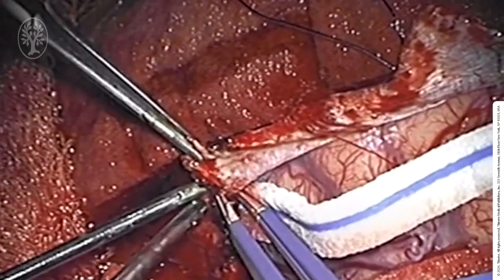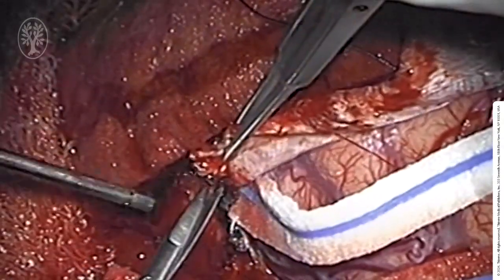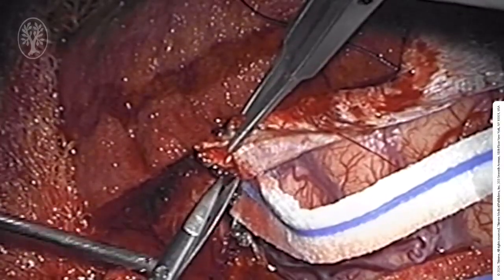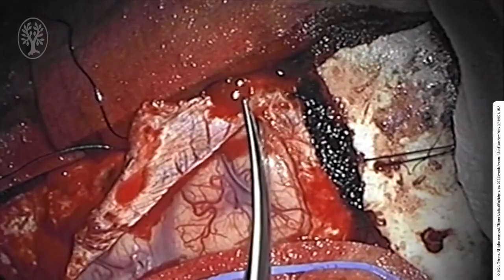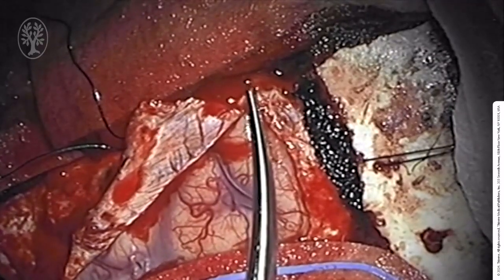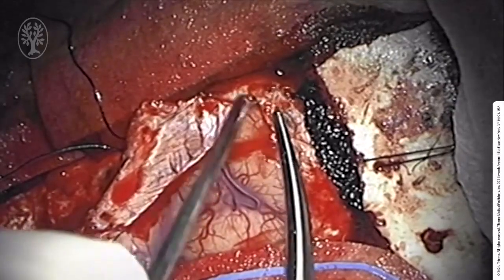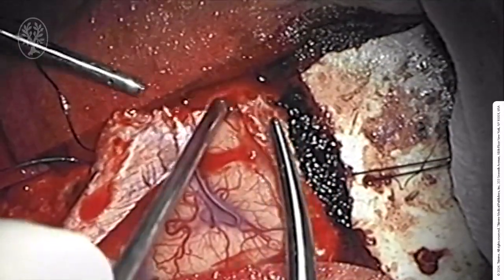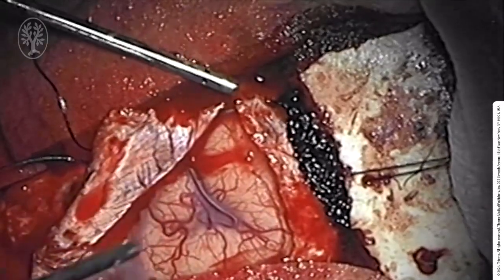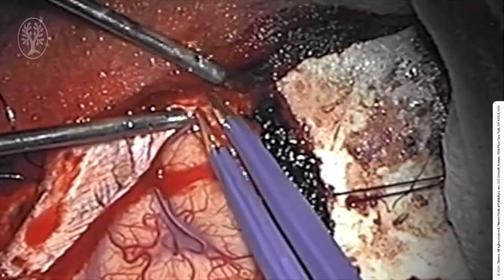The dura is opened to flap medially, and great care must be exercised to avoid cortical vessels which may enter the dura well lateral to the sinus. The dura is trimmed to the lateral margin of the sagittal sinus for optimal visualization. The sinus may create venous lakes between the folds of the dura which extend laterally. The surgeon must maintain suspicion for their presence to allow for early detection and coagulation to prevent significant bleeding.